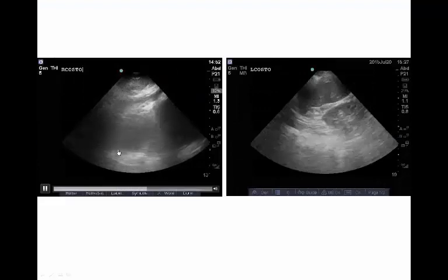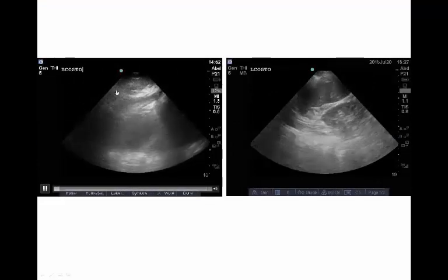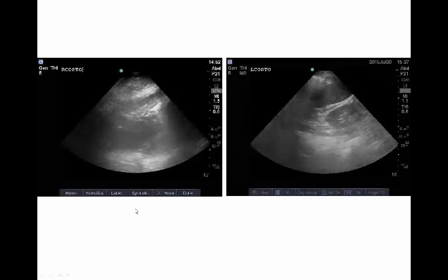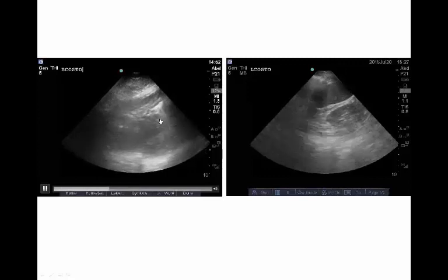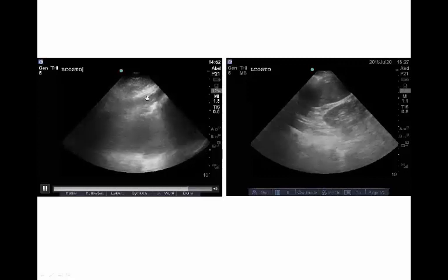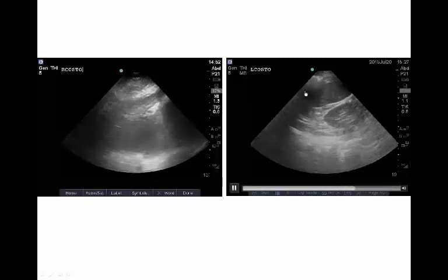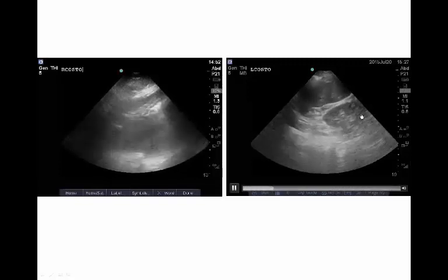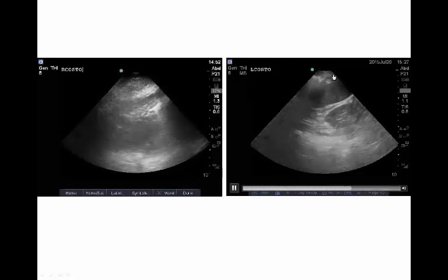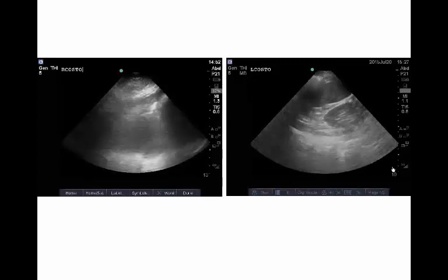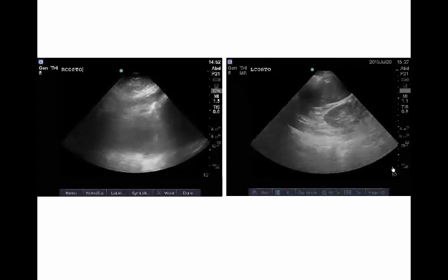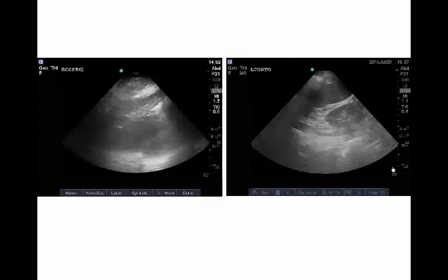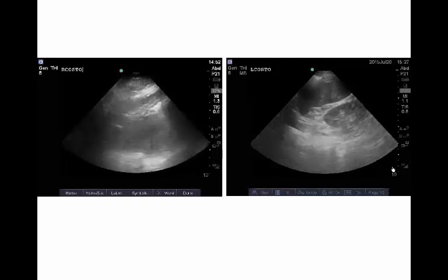Here are a few more views of the ultrasound. This is the right costophrenic angle, and here is the left costophrenic angle. Here you see the diaphragm with the liver border, and there are some areas of consolidation. On this side you see the spleen and the left kidney, with some lung curtaining into the view. In this patient, a diagnosis of ARDS was made, and she did not actually require a CT scan.